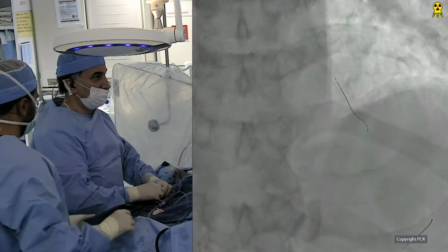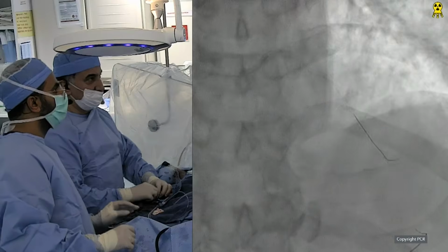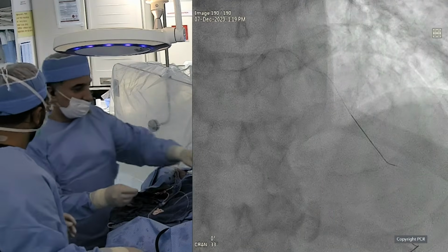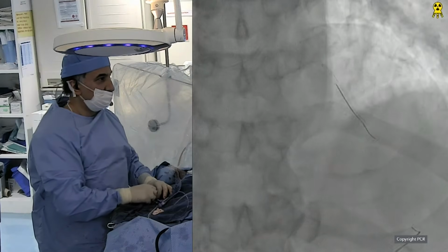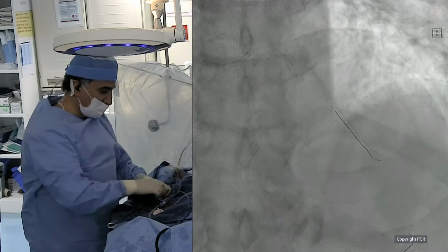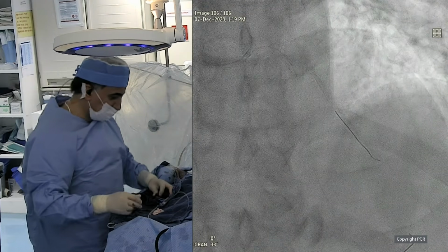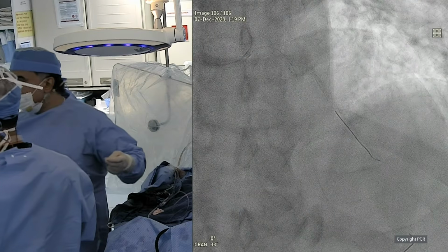It's a tricky angle with calcification. So I mean, we know it would be a challenging case, and I think you're making excellent progress there. Whilst you're working, we'll balloon again with a larger balloon. We'll take a 3 by 30 and see if we can cross. Okay. If not, we'll take a guideliner.